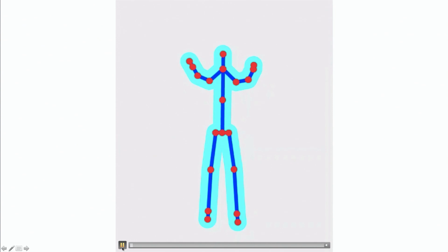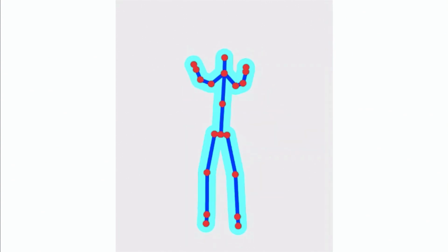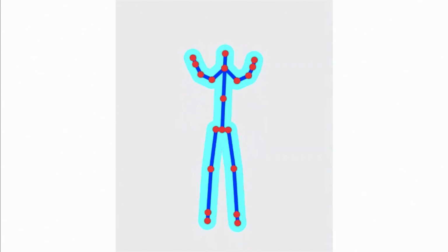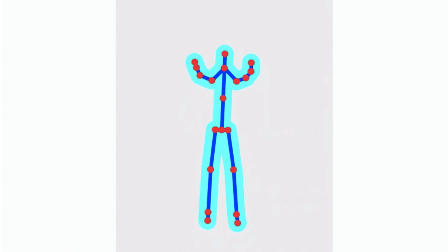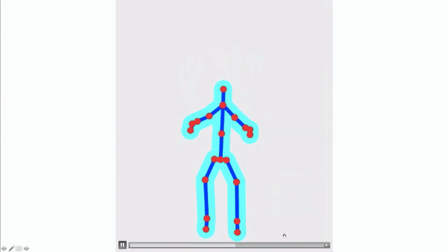One of the ideas we had was having it superimposed like this. So these are both me. The light blue is my reference, which is my supposedly perfect exercise. And the one in the blue is what I would do if I was at home trying to follow along with it. So this would act as a guide. And it turns out patients did not like this at all. It seemed very distracting and they were confused. They didn't know which one was them, which one was the actual reference exercise.